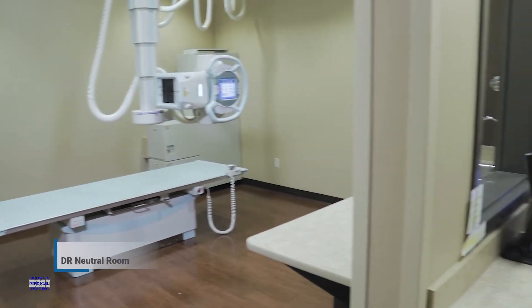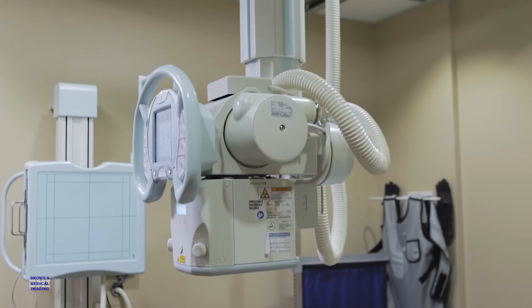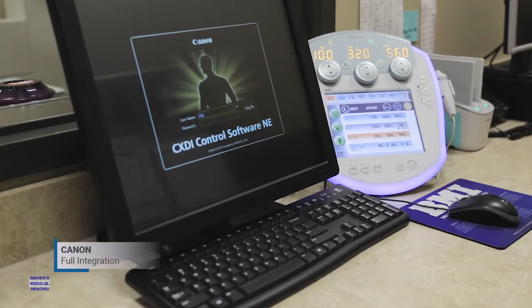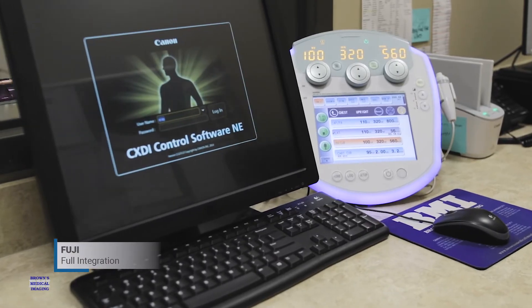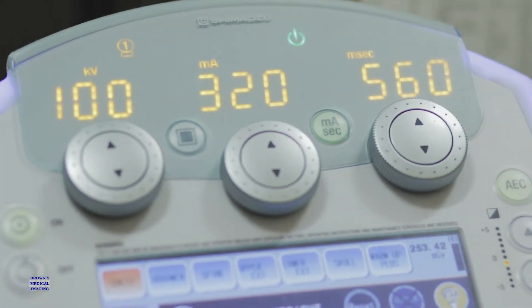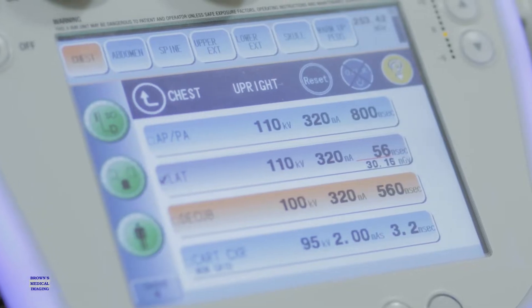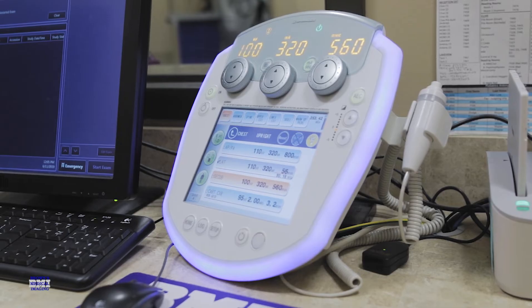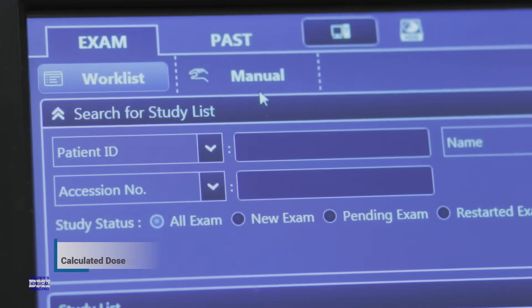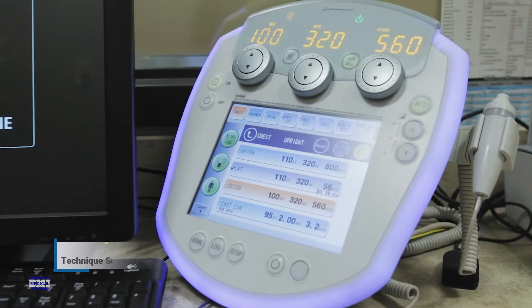The Shimatsu RadSpeed Pro X-Ray System is a DR neutral room, meaning it can be fully integrated with a variety of DR manufacturers, such as Canon, Konica, or Fuji, based on customer preference. Shimatsu's ability to fully integrate with various DR platforms allows us to send critical data from the equipment to PACS. Information such as patient dose, calculated dose, and technique settings can all be sent to PACS along with the exam data.